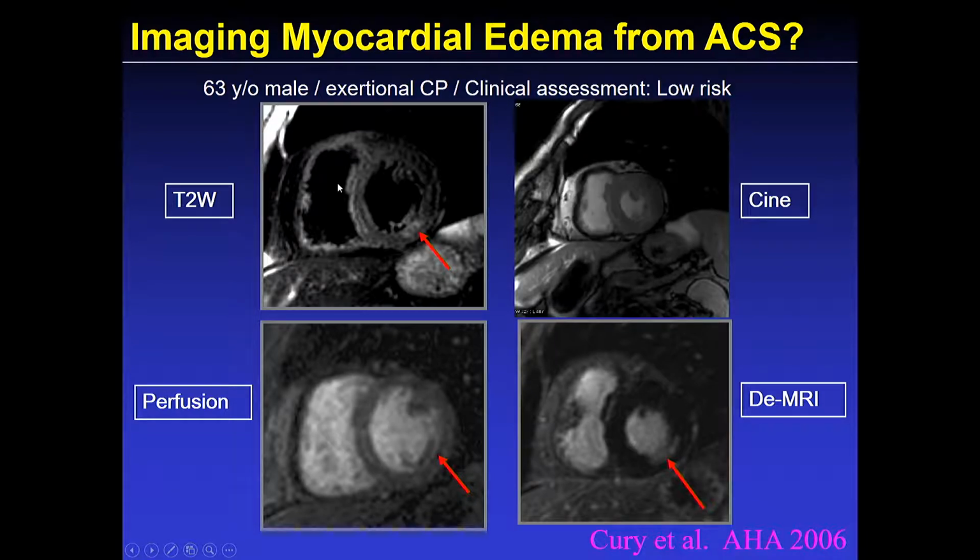But the T2 weighted image here really helps because it tells you to differentiate whether it's an acute change or chronic changes, because chronic infarction will not have T2 signal, will not have edematous tissue signal. But in this case, this matching region shows brightness on T2 weighting, suggesting there's focal local edema. So that indicates that this is an acute myocardial infarction with regional matching edema.